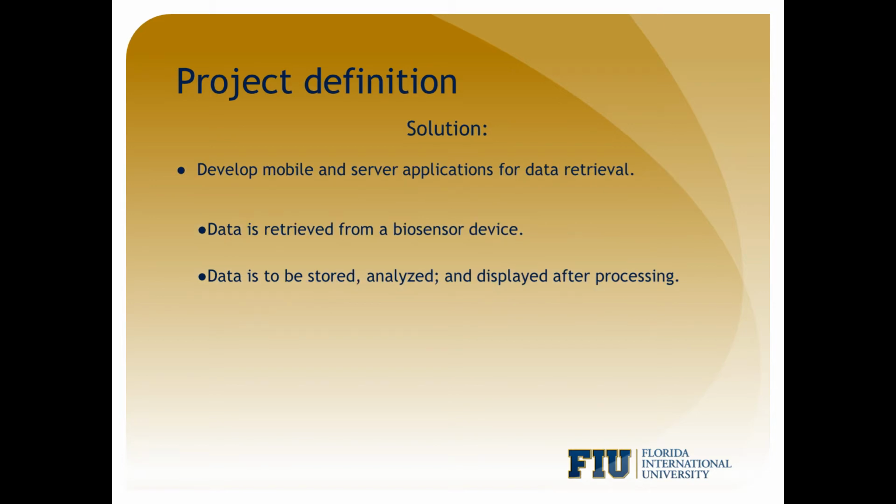The system we designed allows the user to use an Android application to connect to a BLE biosensing device's sensor and read their data. Additionally, while the app is connected to a sensor, it will automatically store the current reading of that sensor in a database every 30 seconds. The user can also view real-time graphs of biosensor data and graphs with data in user-specified ranges in the app.